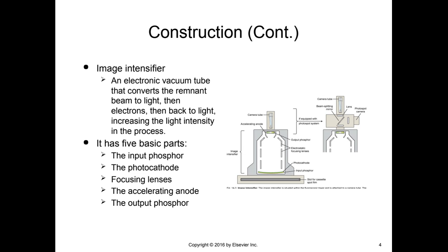One thing about our fluoro machines: they typically operate at approximately 2 to 5 mA. All right, so put that in your notes.